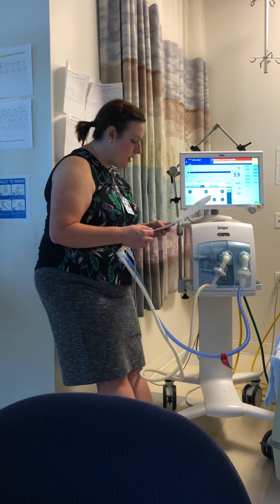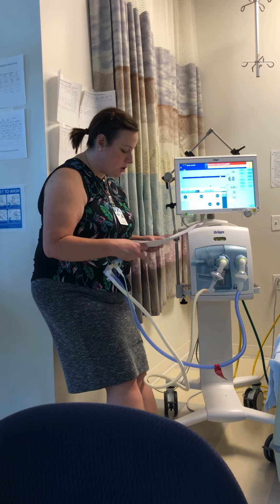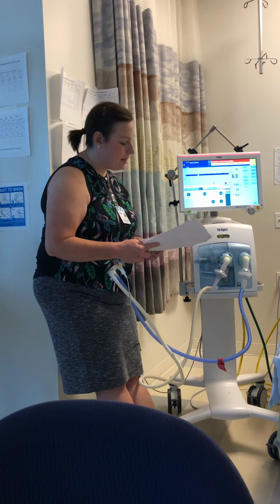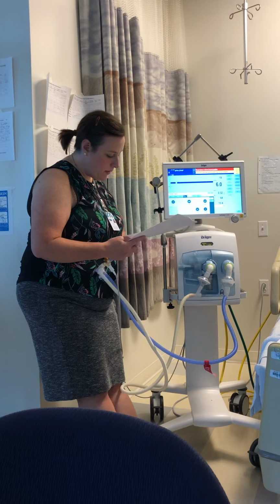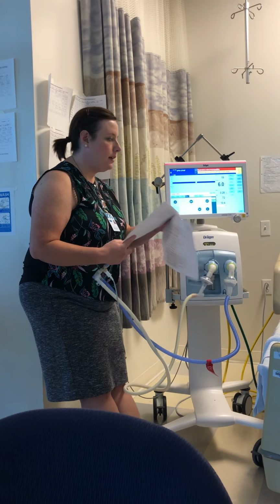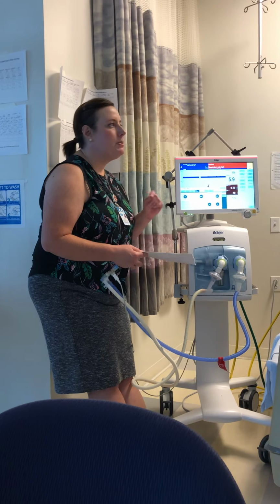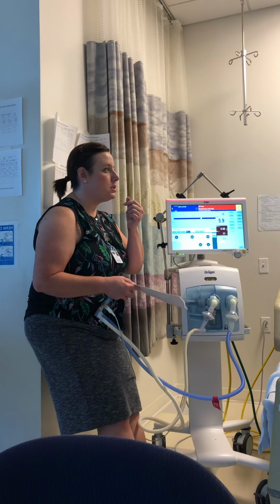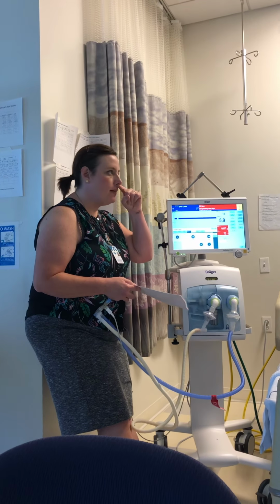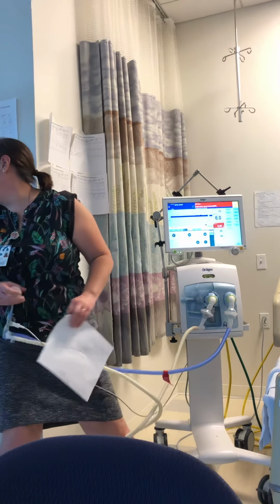Evaluated the work of breathing, evaluated the ventilation via ABG, transcutaneous monitoring, and pulse oximetry, evaluated the heart rate and blood pressure, evaluated the chest x-ray periodically. Most places will do it just once a day. Evaluated the nasal septum. I usually did this at the very beginning of my shift. I would take the prongs out just slightly so I can see the septum, see if there's any skin breakdown.